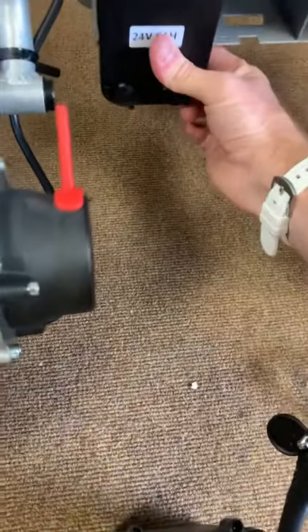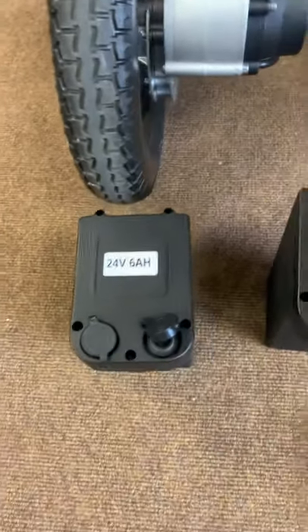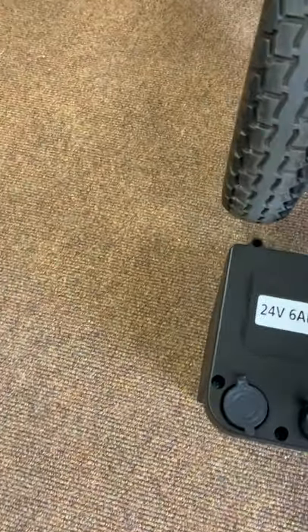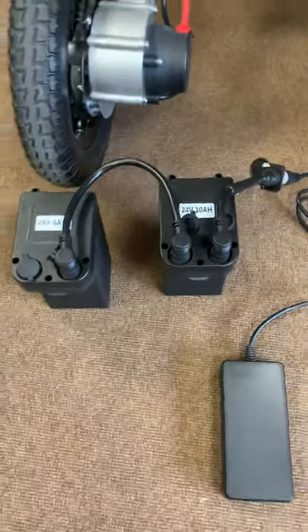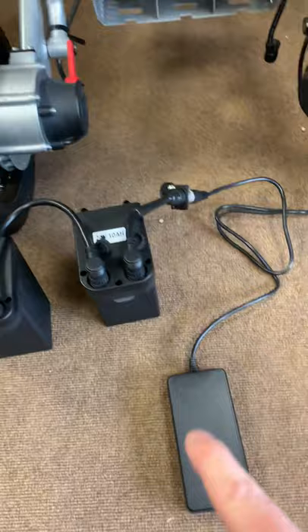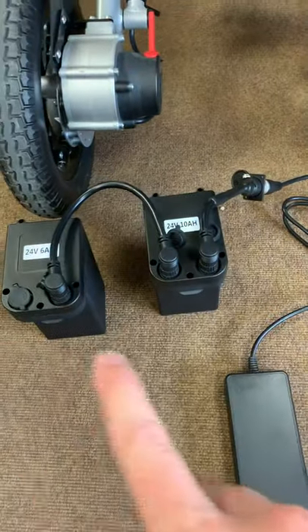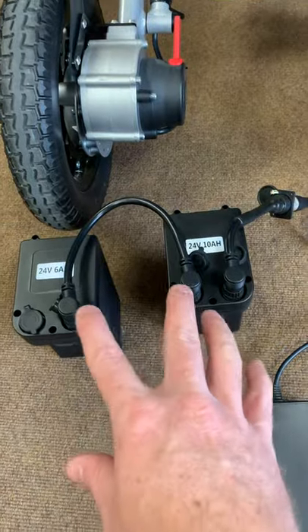If you want to charge both batteries at the same time, simply remove the other battery, open the tab up, and add your joining lead. Now, just as you would run your batteries in parallel in the chair, you can also charge your batteries in parallel — as long as you've got these two batteries linked, you're charging in parallel.